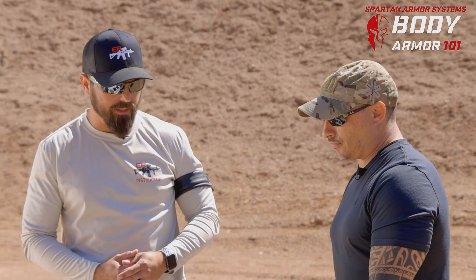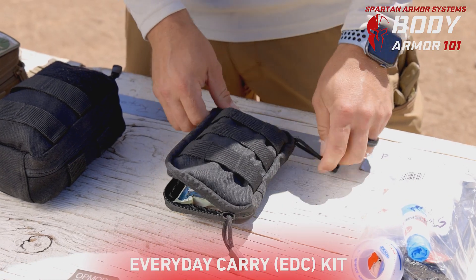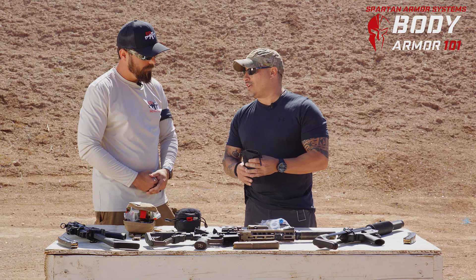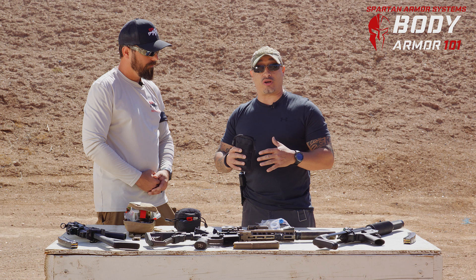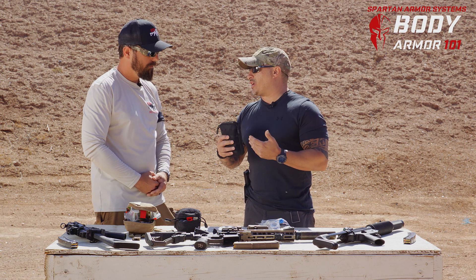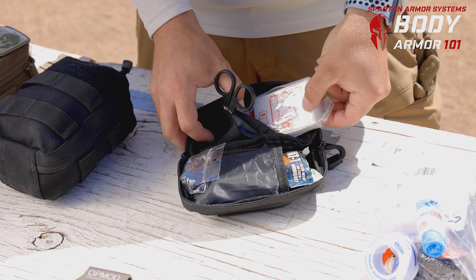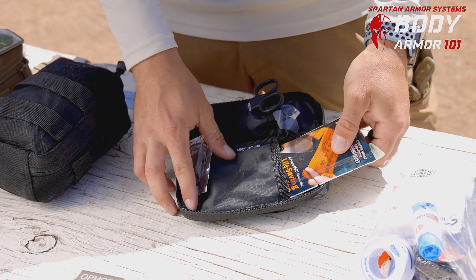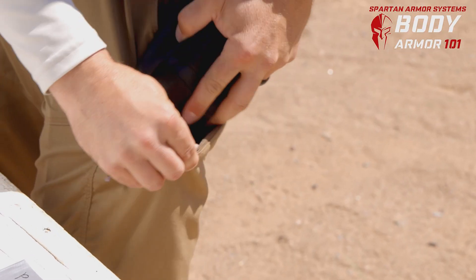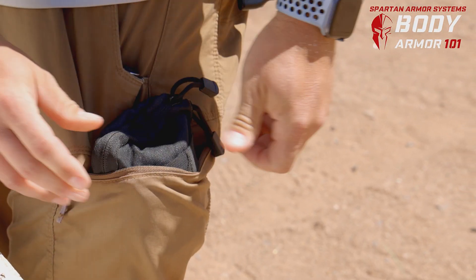Next let's take a look at the EDC. What I like about the EDC kit is it's tiny — it looks like it's designed to fit in a cargo pocket. At the Everyday Carry level, if you're not going to be running out there with backpacks and everything, you need something that's small and concealable. It's going to have everything you need for a tourniquet, immediate bleeding control, and anything to take care of yourself in that situation — convenient, and not everybody knows what you're carrying.